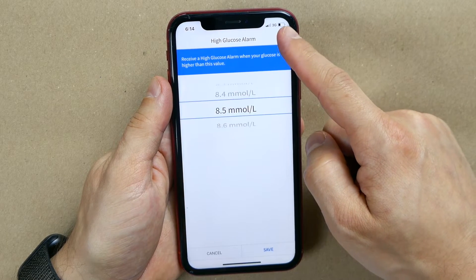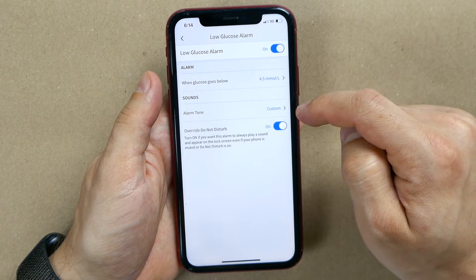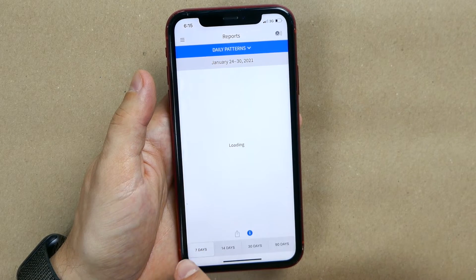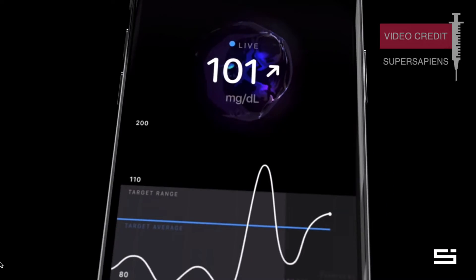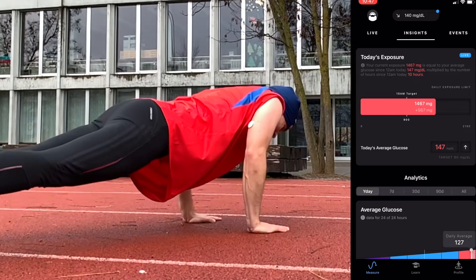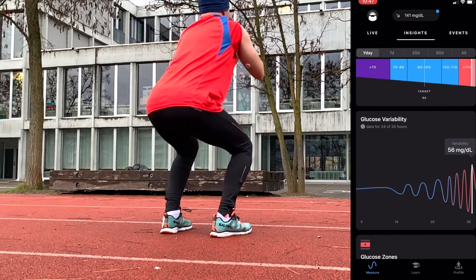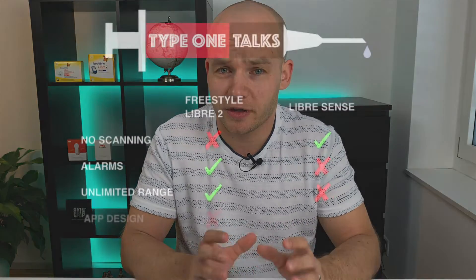The fourth difference is the app. For me the design of the LibreLink app used with Libre 2 is average — maybe slightly below average. It has extremely helpful functions but looks very old school. The Super Sapiens app for LibreSense is totally different: black background, colorful animations, detailed statistics. You can track meals, exercise, sleep, stress and more, and the app analyzes the data and shows nice overviews that LibreLink doesn't offer. So this is a clear point for LibreSense.